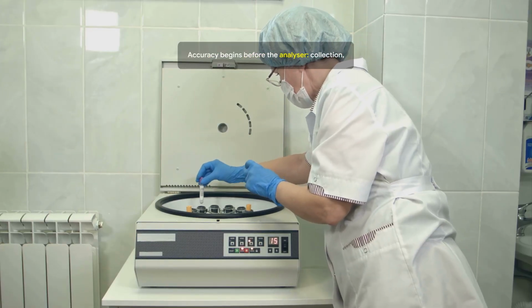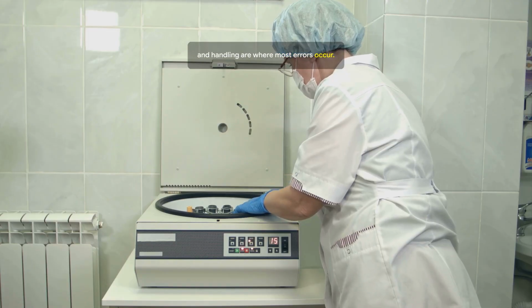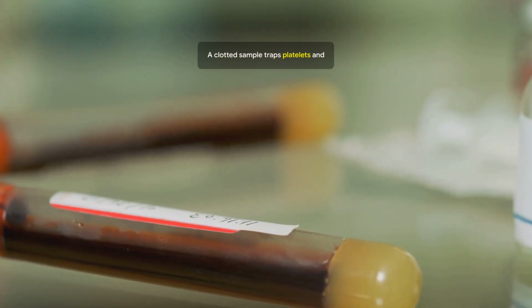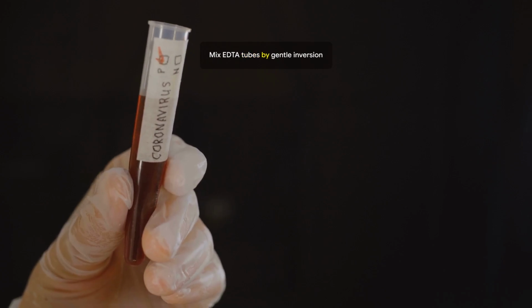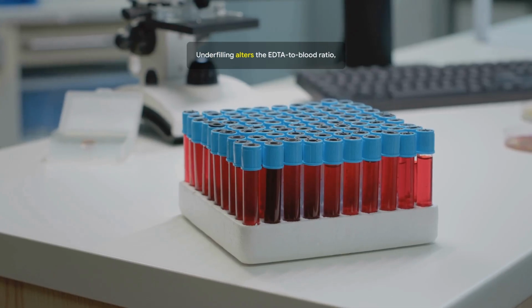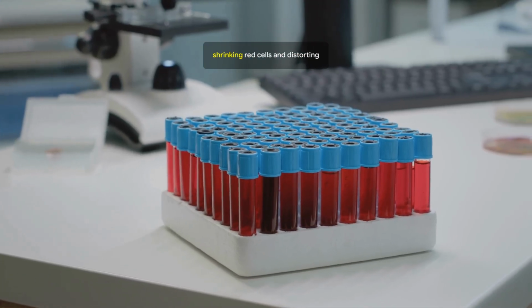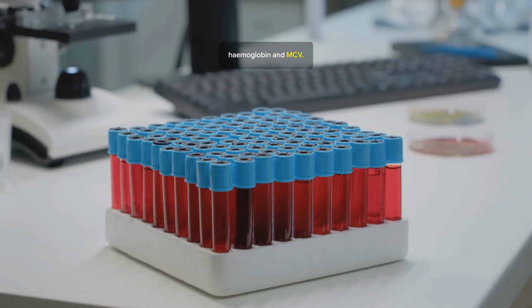Accuracy begins before the analyzer. Collection, transport, and handling are where most errors occur. A clotted sample traps platelets and produces a falsely low count. Mix EDTA tubes by gentle inversion immediately after draw to prevent clots. Underfilling alters the EDTA-to-blood ratio, shrinking red cells and distorting hemoglobin and MCV.